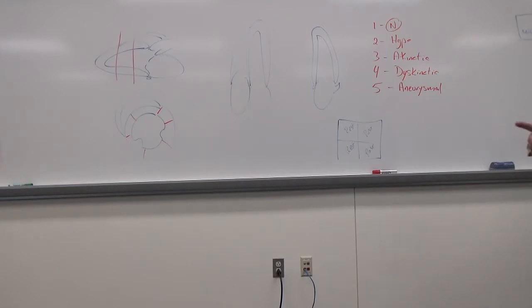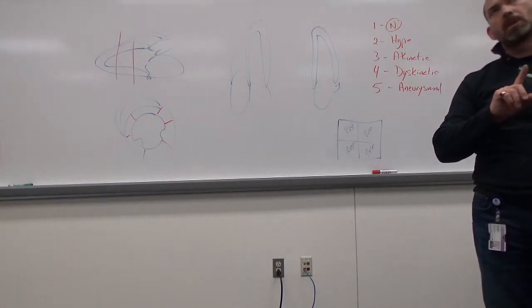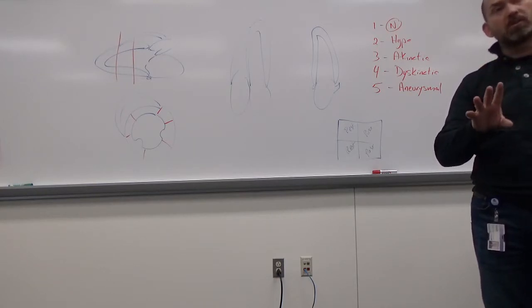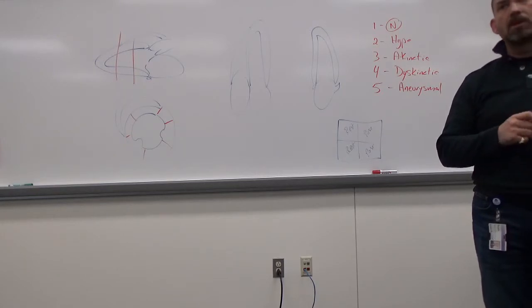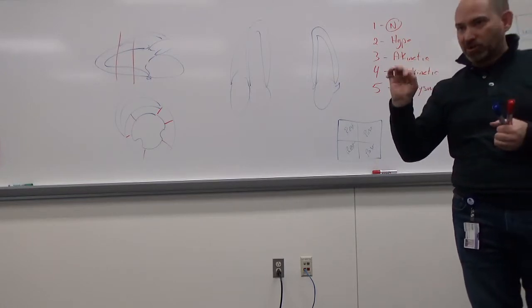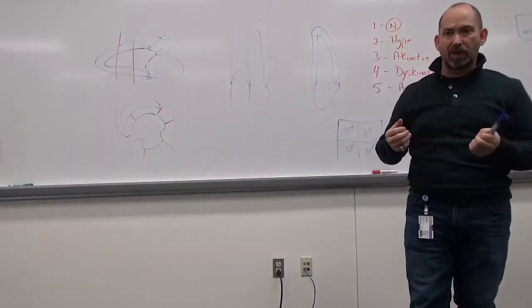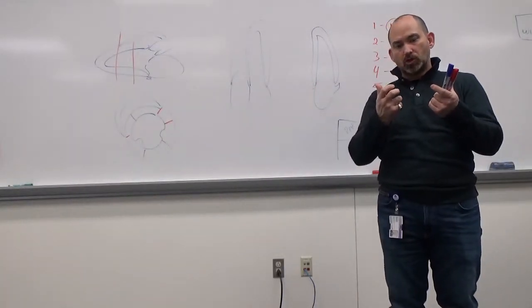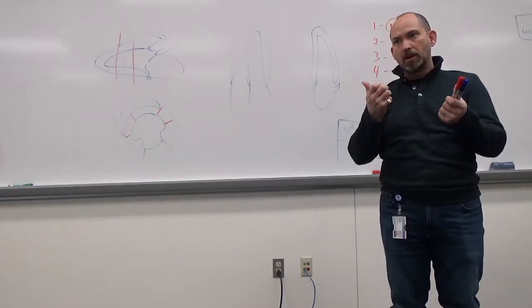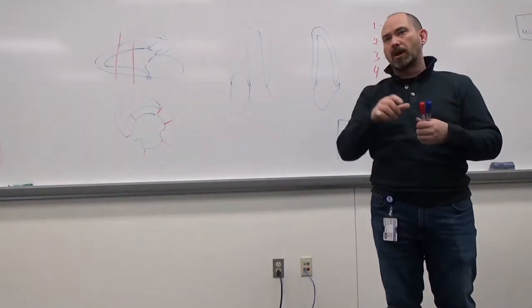Beyond that, I brought up contrast agents. So what does the contrast agent do? When we talked about the right ventricle and interatrial septum and looking for shunts, what type of contrast were we using for that? It's agitated saline. These are bigger, small bubbles. We don't want big air emboli going into veins. We take two syringes with a stopcock on it, and a little catheter that goes into the blood, and we go back and forth with it to agitate it. Then we inject it. That only goes through the right heart.